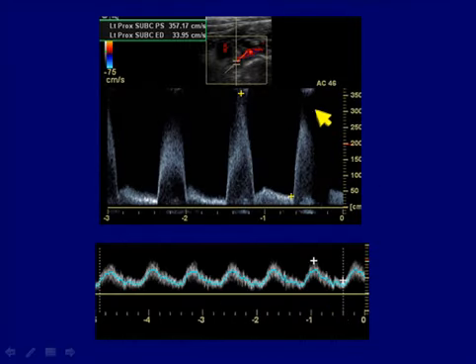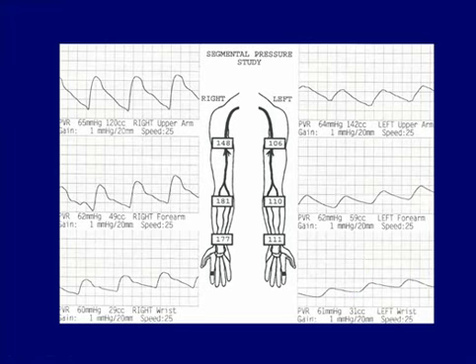When we see a subclavian, though, that looks like this, we can appreciate that there is something going on. Again, we don't even have to look at the numbers. You can see there's extensive spectral broadening. The waveform is kind of rounded. This is a stenotic signal, and in this case, we've got velocities in this example peaking out of over 350 centimeters per second. Downstream, again, we would expect turbulence and rounding and blunting of the waveform as shown below.